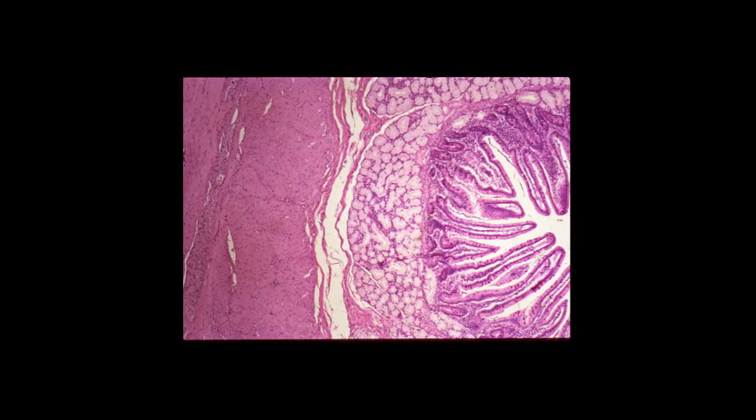This is the second podcast for the digestive tract. In this image, identify villi, crypts of Lieberkühn, simple columnar epithelium with darkly stained goblet cells, lamina propria, muscularis mucosae, and the submucosa with characteristic submucosal glands or Brunner's glands, and also the muscularis externa. The presence of these submucosal glands would make this image one of the duodenum.